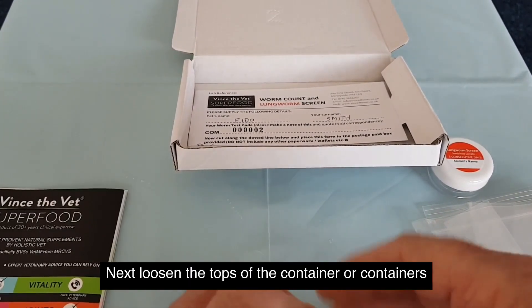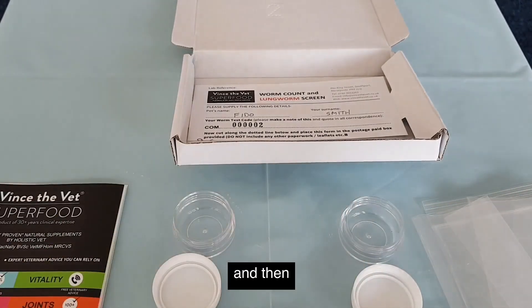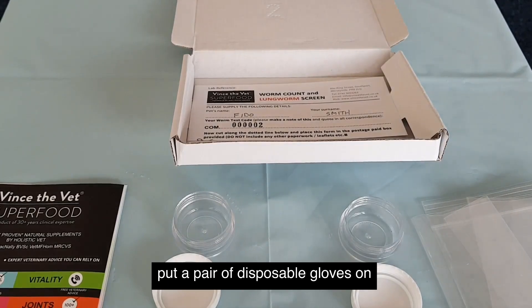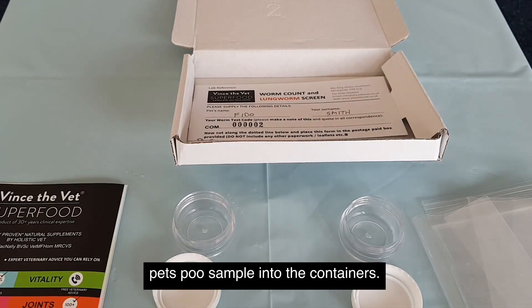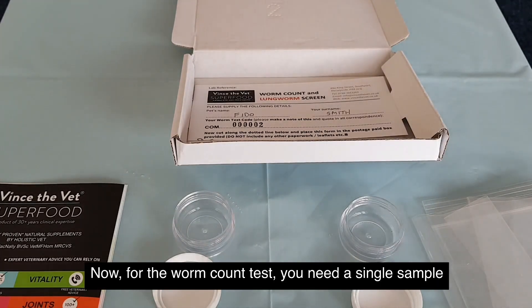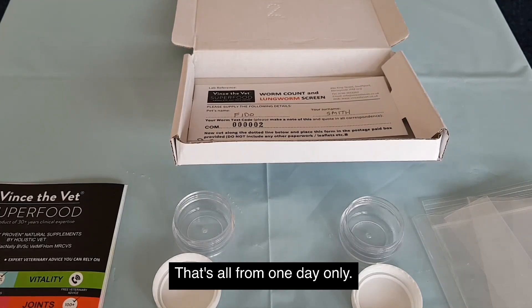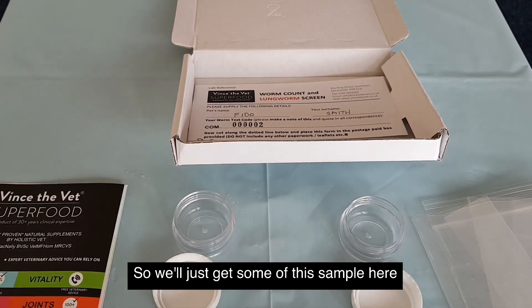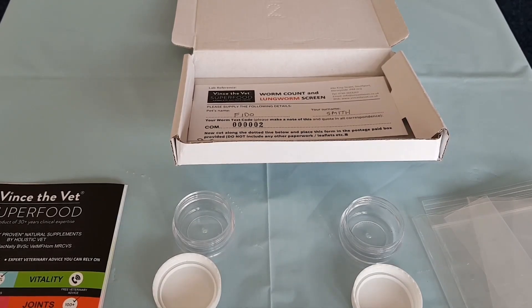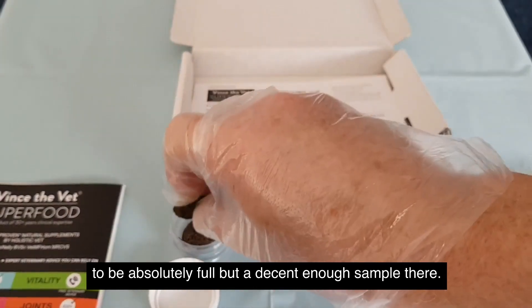Next, loosen the tops of the container or containers. Then put a pair of disposable gloves on so that you can put your pet's poo sample into the containers. For the worm count test, you need a single sample of your pet's poo — that's all, from one day only. Get some of the sample and put it into the single worm count container. It doesn't need to be absolutely full, but a decent enough sample.